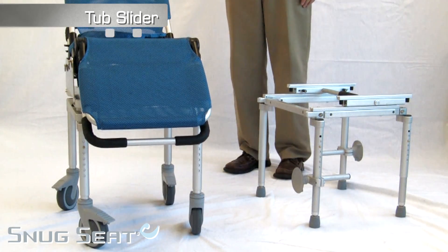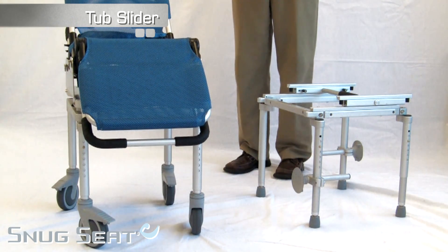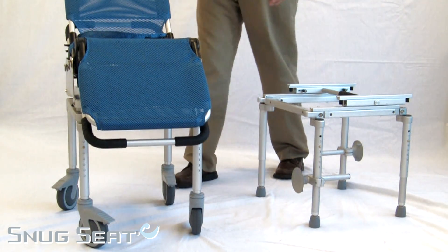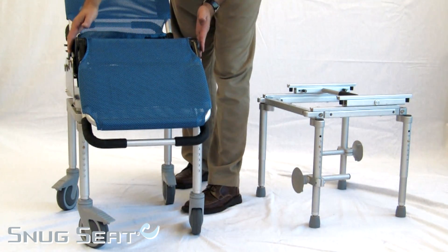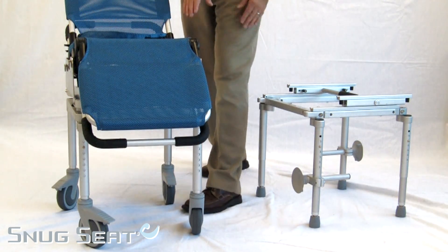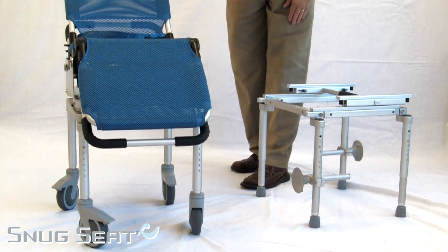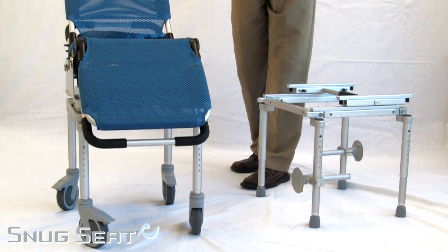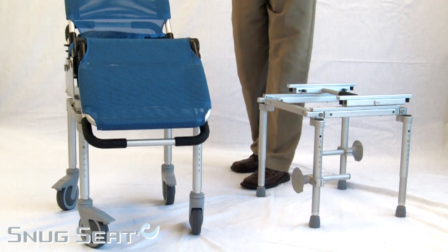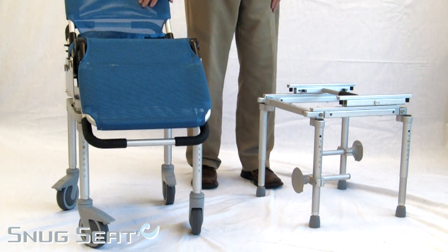Another combination with the Manatee is with an association with new products and their tub slider. By installing the brackets on the Manatee, it fits within the rolling shower base. This base allows for transferring the child in another room or where there's more space. Once you place the child in, it's free to roll into the bathroom.